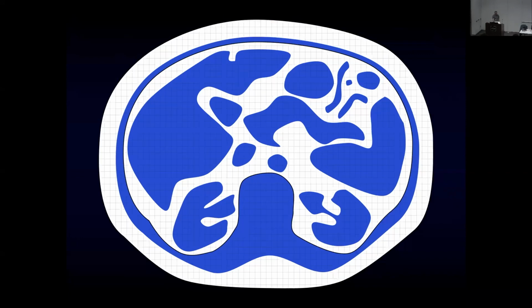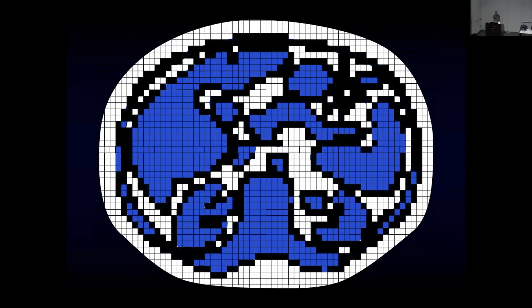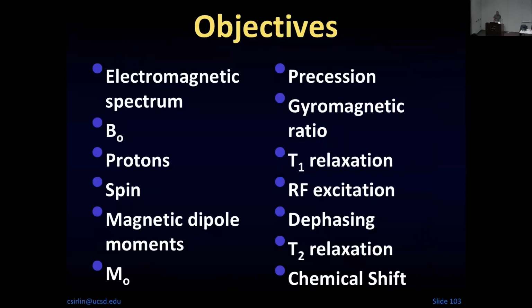The pixels actually have a certain size, as shown by this grid. So now what I want you to realize is that everywhere we have an interface between water and fat, these pixels, like this one over here, contain water and fat. So we're going to have cancellation of signal everywhere that we have a boundary between water and fat. So those pixels go black, and that's what causes this India ink artifact.